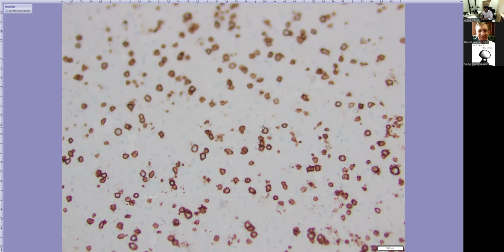But I also ordered the second molecular test, which was MyD88 mutation studies. MyD88 is a gene, and the L265P locus mutation of that gene, if positive, will support a diagnosis of a primary CNS lymphoma, because MyD88 mutations can be seen in primary lymphomas arising in immunoprivileged sites like brain or testes or breast.